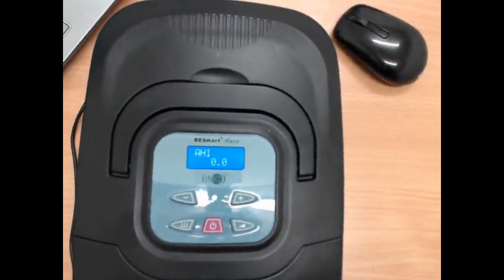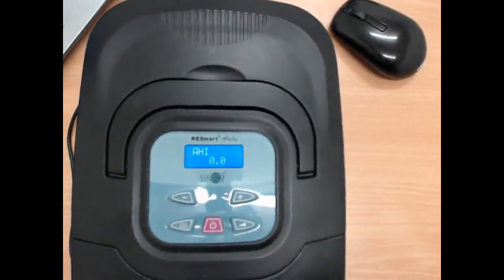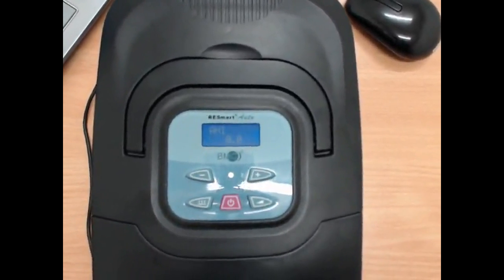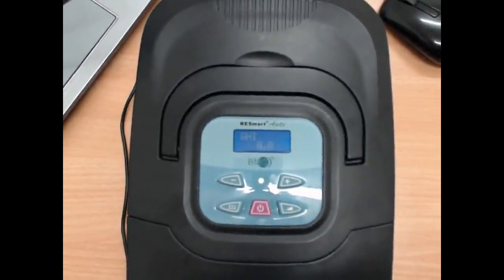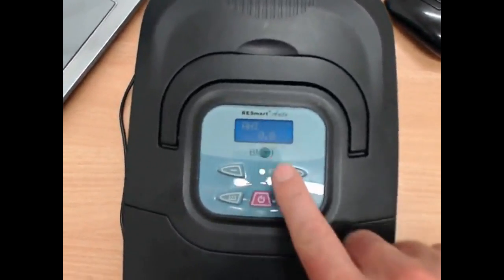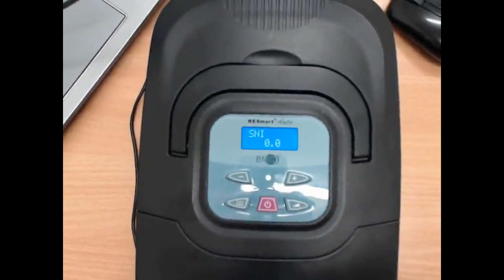So if you're coming down off a really high level, say your apnea-hypopnea index was 80, you might sometimes find it harder to get that person down to less than 5, so it's all relative. If they get down to 7 or 8 or 9, it's still a big improvement, but the goal is to get less than 5, okay? So we can adjust the pressures and things like that in the mode to try and check out our AHI and get that down to as low as possible, and then we've got the snore index as well.